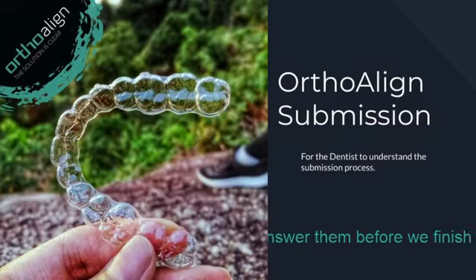Okay, so the next thing we're going to do is acquiring the data, for example taking the impression or using an intraoral scan. For the intraoral scan, over here we can see the Trios intraoral scanner. If you have a Trios intraoral scanner, you can definitely submit cases to us through 3Shape Communicate. But if you don't have a Trios intraoral scanner, you can always send us your STL files or OBJ files in the format that your scanner outputs. We can definitely accept third-party scanners, and of course we can accept STL files of all kinds.